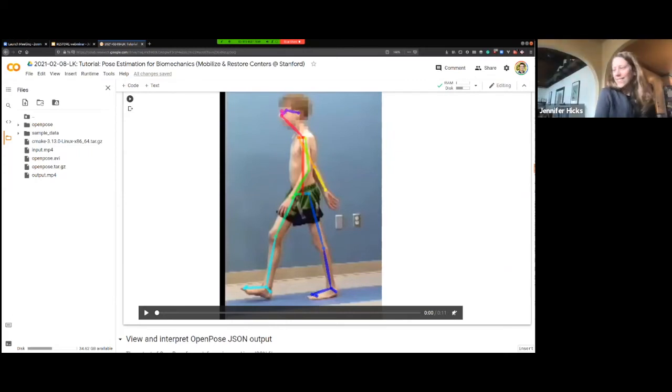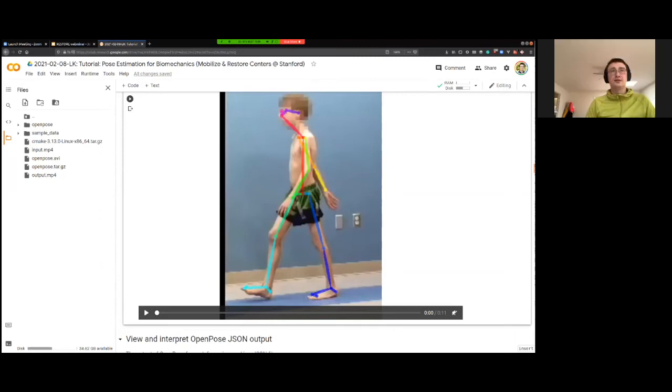Okay, thanks, Lukasz. Now from Carla Musali, do you need some kind of affine transformation if, for example, the camera is filming from a different angle than the data was trained with? For sure. We had this question about adversarial approaches in the first part of the webinar, and there are ways to make our models way more robust, but we didn't do any of that.